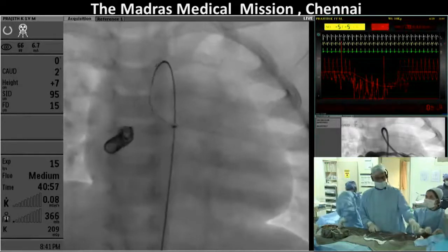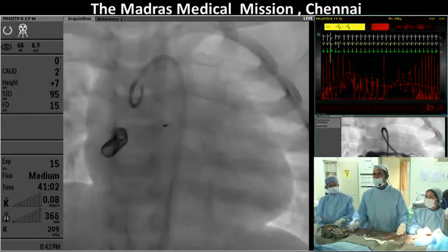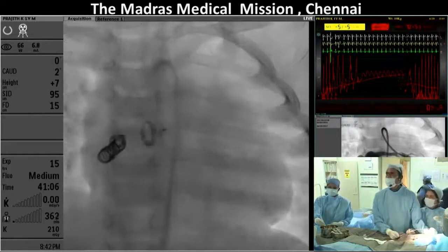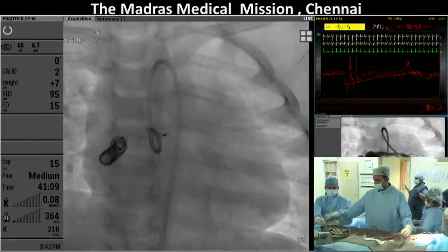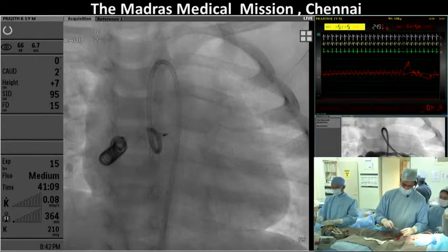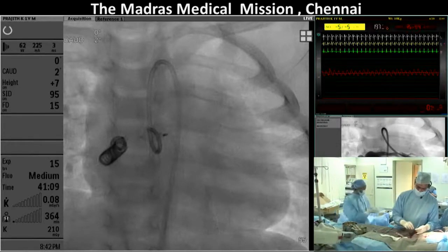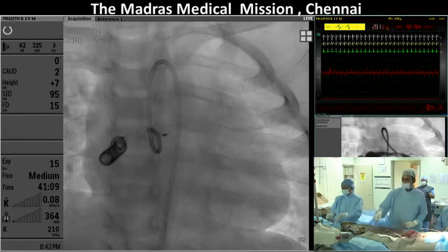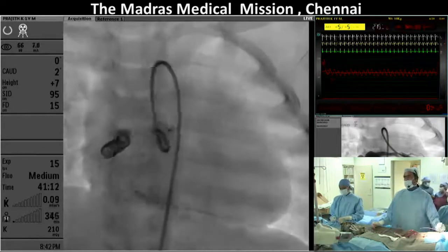One point I couldn't understand: what is the harm, what is the problem with keeping the distal parts of the fistula patent? Is there any harm? No, there's no harm. The point we were trying to make was that if there is an aneurysmal sac with flow in and out, then over a period of years there may be thrombosis, microthrombosis and emboli coming up. That's the only thing. But we have no evidence or data, unless, Jim, you have, of those aneurysms causing a problem in the muscle. I'll show you our data later.